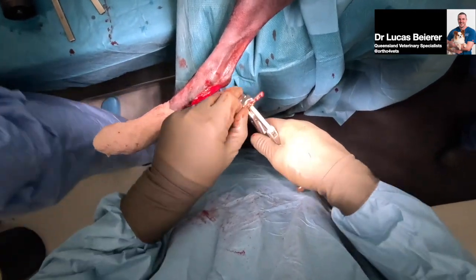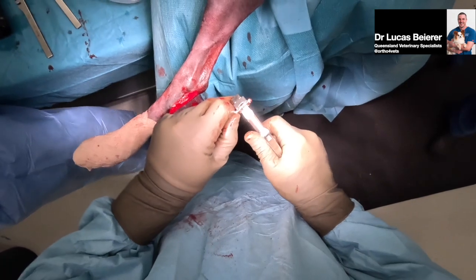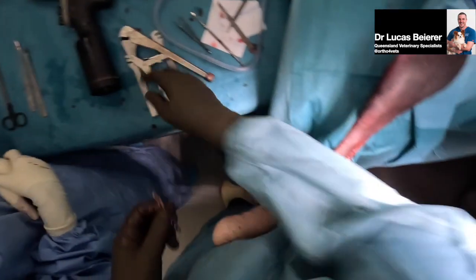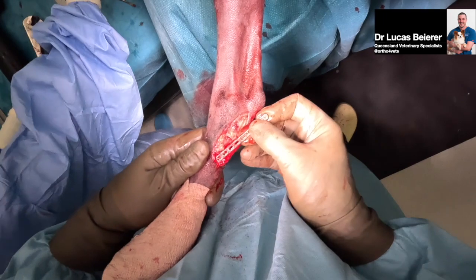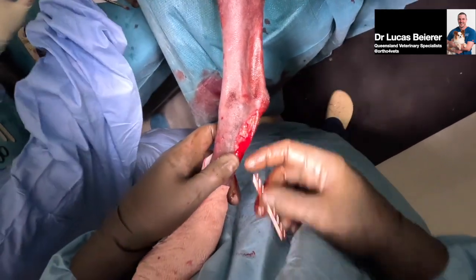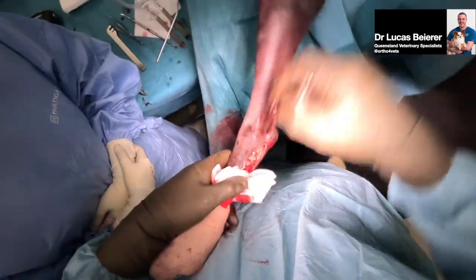I think there's some experts at doing this. One of the colleagues at the practice who's just retired, Jason Beck, he's done a lot of these and he's meticulous. He can do a fantastic job of contouring, but when it came up in the days when everything needed contouring perfectly, I don't quite have that skill set. There's a balance of surgical time and contouring. Just wants to bleed.